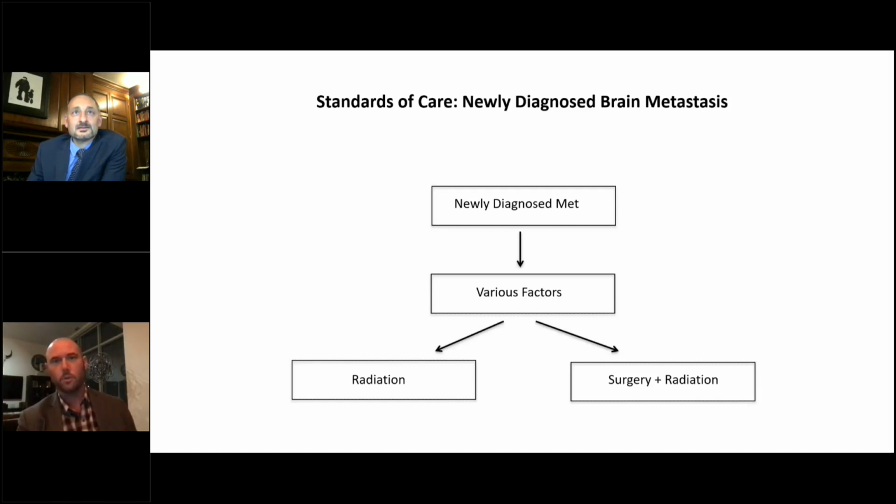And Joe's obviously an expert user as well. I've done hypothalamic hamartomas with great success, actually, and that's a very good use for this technology. So I would say we approach very cautiously. My tumor partner Brian Williams and I did this together, and I think we were both terrified doing it. Certainly I would not be cavalier checking these things out. Oftentimes people will show us someone's first case and it's like some 5 centimeter thalamic lesion. Don't start with that. That's just not where you want to start.